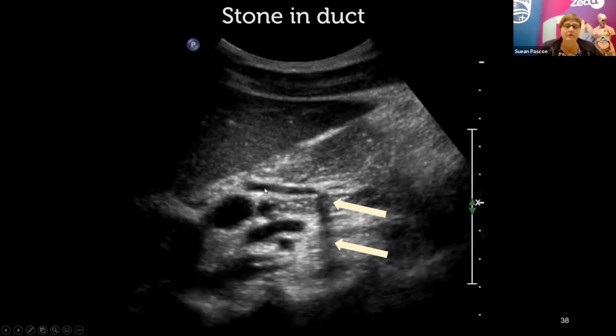But if I haven't managed to see very well, and I've only seen it for the best pictures, I'd only take the pictures once they're in the lateral decubitus position. The rolling is just about me getting stones out of the neck. And if I can't see anything supine, I start lateral decubitus and then I stand them up erect to make sure that those stones are mobile and do move out. For bile duct, I just go straight to the lateral decubitus position.